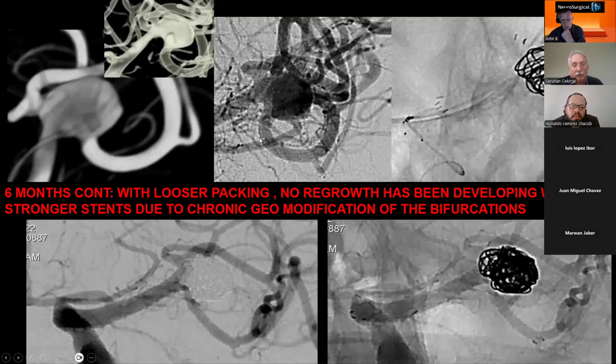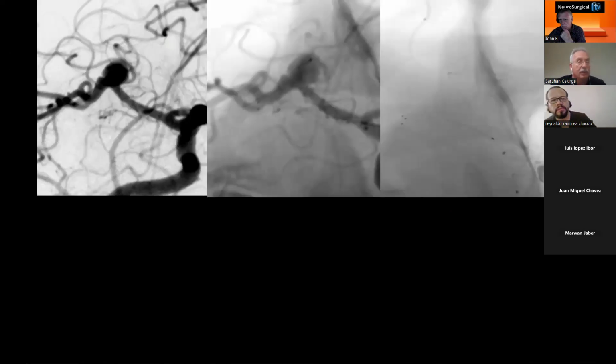Look at this angle, which was maybe 30, 40 degrees. Now this is 90 degrees. So the angle is completely changed here. And because of this angle change, then you have the result.